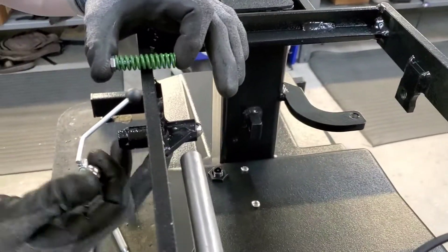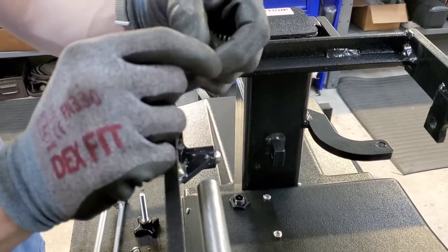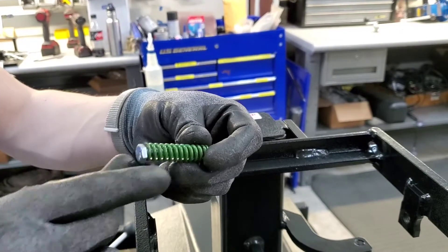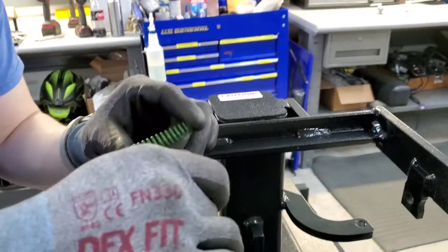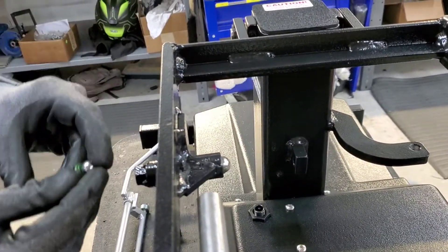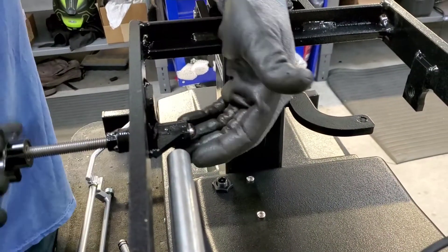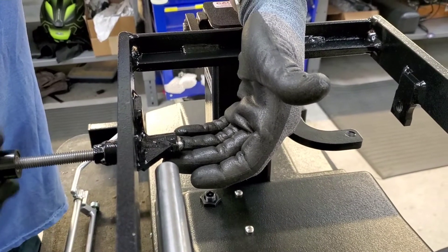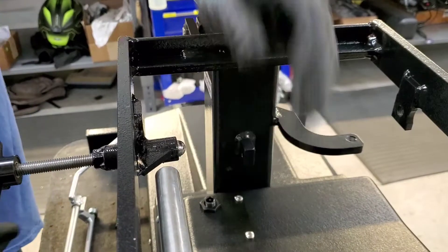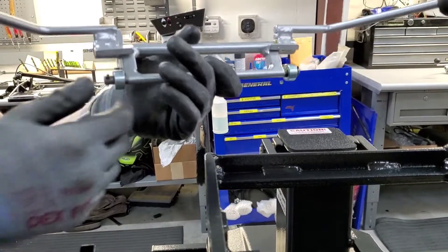This is part of the drop mechanism. Inside this black tube there's a screw or bolt at the end, a spring that goes around the screw, and a half-inch ball bearing sticking out. What this assembly does is: as the tension knob screws in, it pushes that ball bearing tighter and tighter into the hole, which is what actuates the actual drop mechanism.